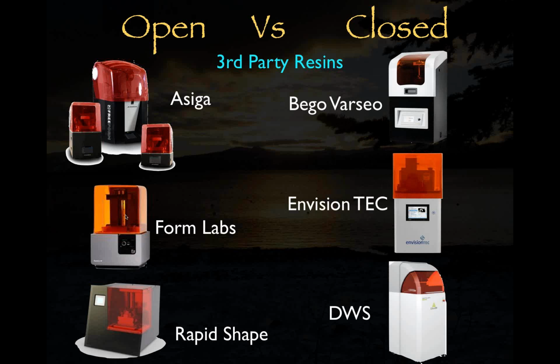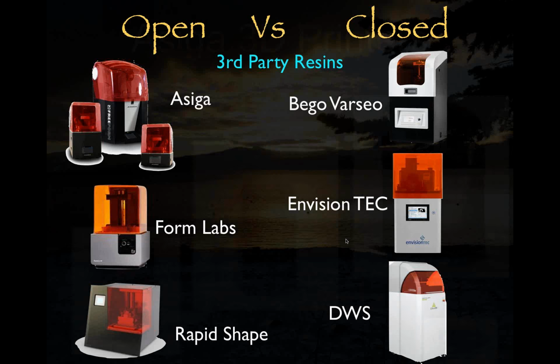Now the Varseo, the EnvisionTech, and there's one called a DWS, which is a competitor in this arena. They are totally closed, meaning that you are forced to use the resin sold by the manufacturer, and I guarantee you that you will pay a lot more money for those.